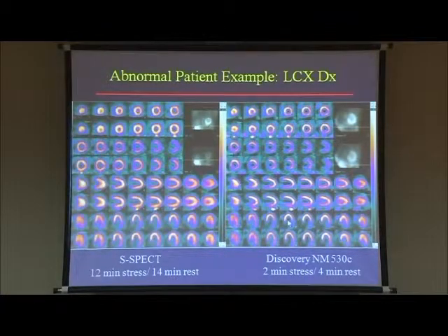You can see not only the increased contrast resolution, but look at the lesion and look how well it normalizes. So the ischemia is also easier to detect. So all these things are working in your favor.